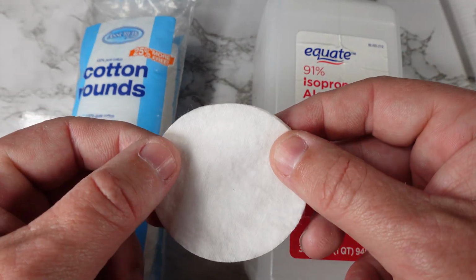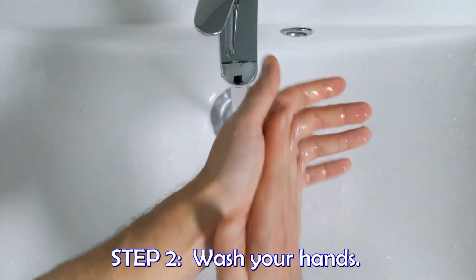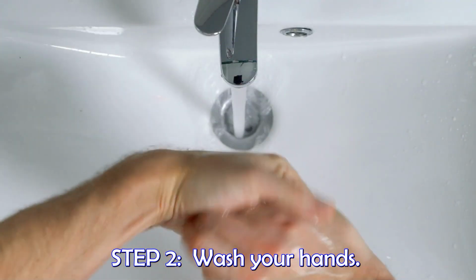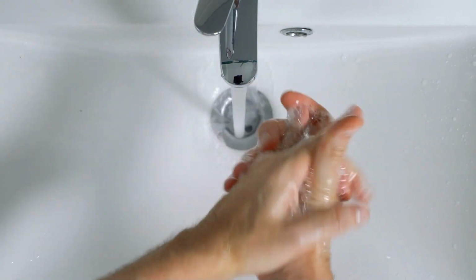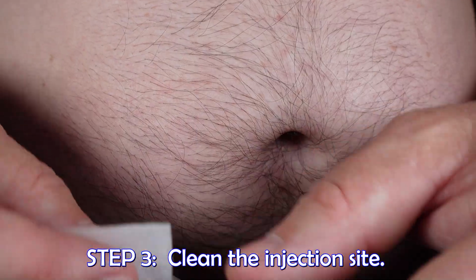All right, once you have that set aside, go ahead and go to step 2, which is wash your hands. The idea is to introduce the least amount of bacteria to the process as possible. All right, so you've taken it out of the refrigerator, you've washed your hands. Now, step 3 is go ahead and clean the injection site. Make sure that you clean it thoroughly.